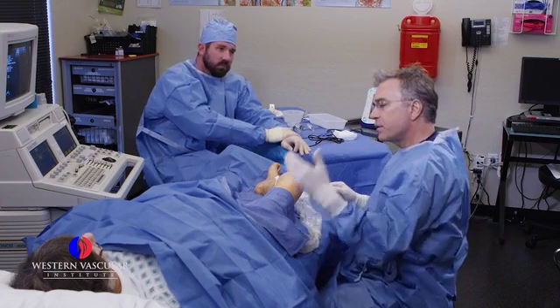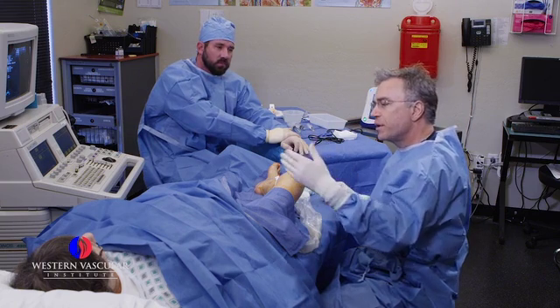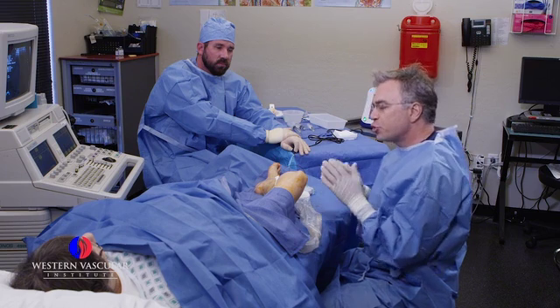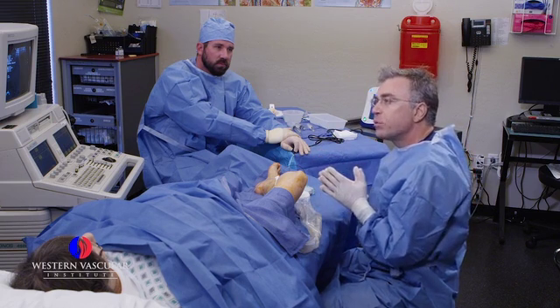When we take another ultrasound of this over time — say three months, six months, one year — by that one-year mark, the vein won't even be identifiable. It will shrink to a little fibrotic cord-like structure and be completely closed.